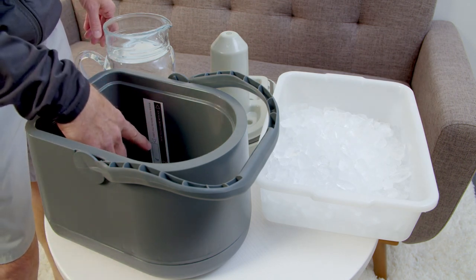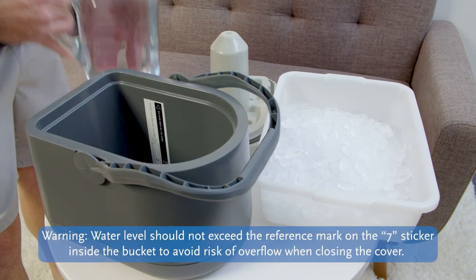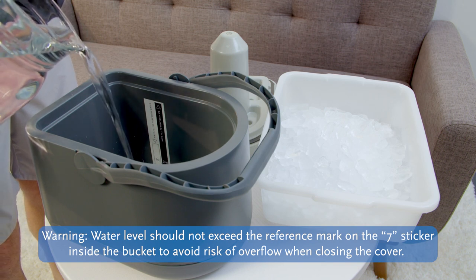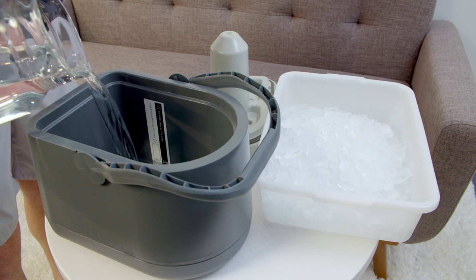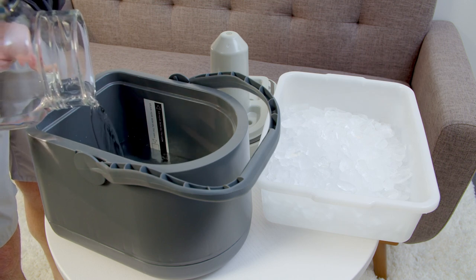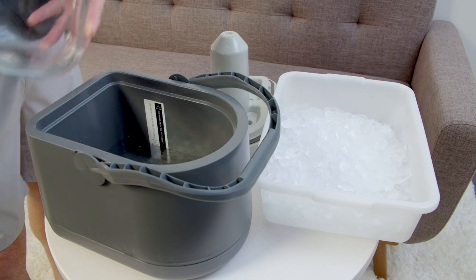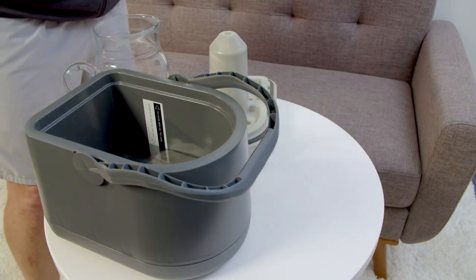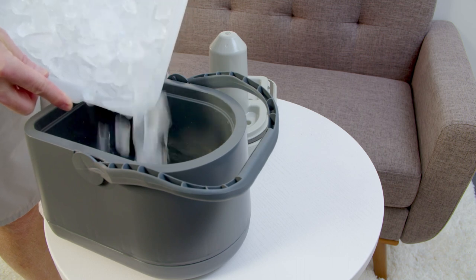Fill the reservoir with water to the indicated fill line. Add chopped or cubed ice to the reservoir up to the indicated fill line.